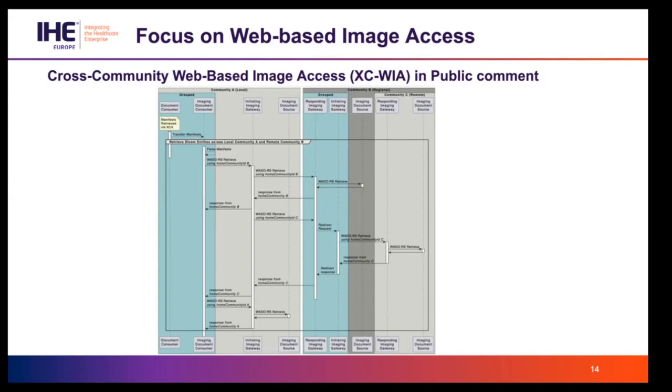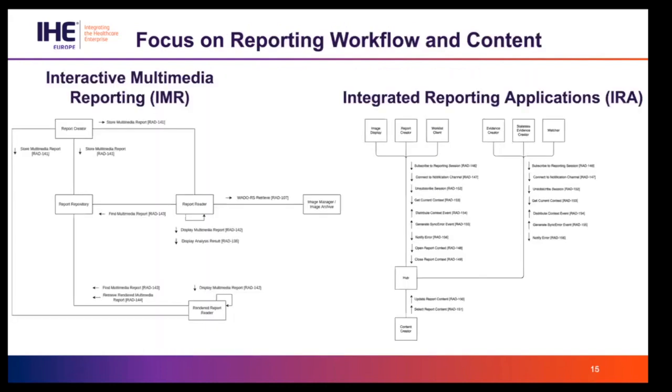And it works in conjunction with the ITI domain XCA profile to allow such an exchange. All the definitions are in the profile, which is currently in public comment, and could be found in the public comment profiles area on IHE.net. And we welcome comments and thoughts about this profile.